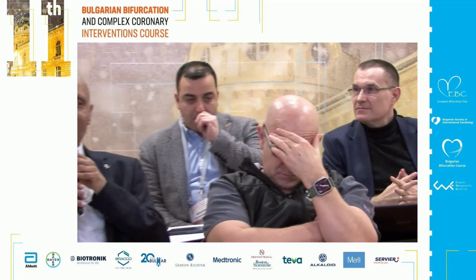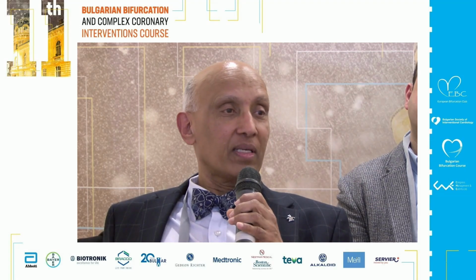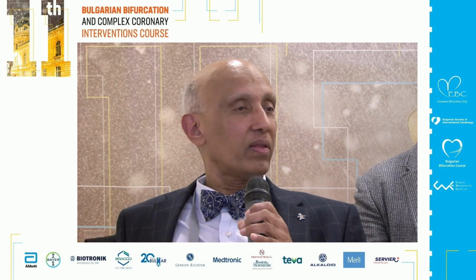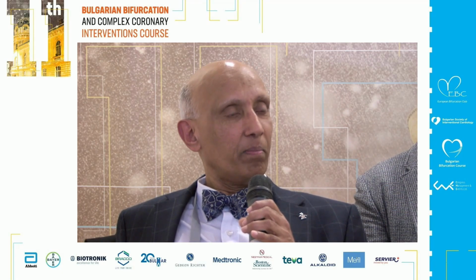So a great presentation with some fantastic cases, but maybe you brought your best cases here. What is interesting is that you mentioned all these other 2 stent strategies. And those of us that have gray hair and have done this for a while have made it very simple. So your attitude of doing provisional stenting alone is what I tend to do also. And even when I do provisional stenting, it's mostly the TAP technique rather than culotte or anything else, because that seems to work the best, both in terms of stent thrombosis and in terms of restenosis.